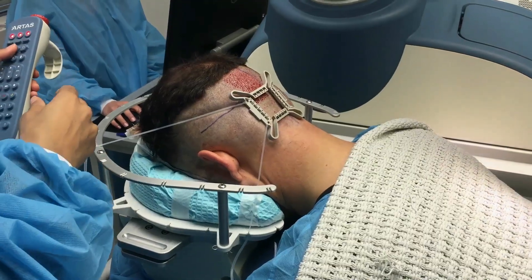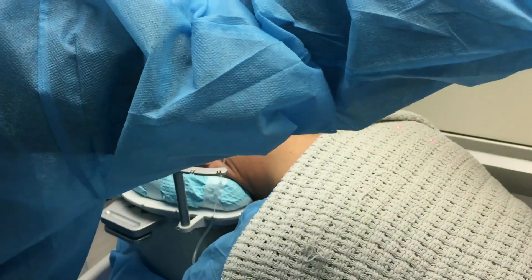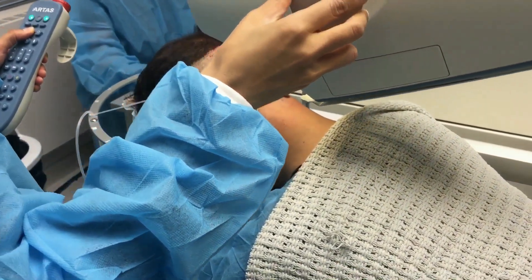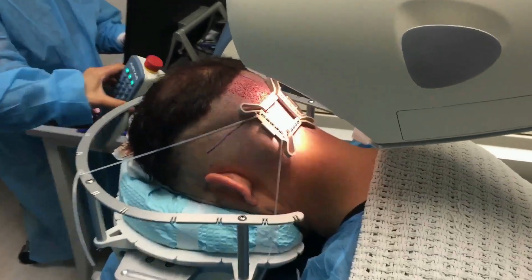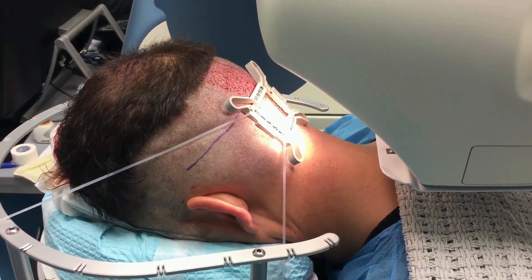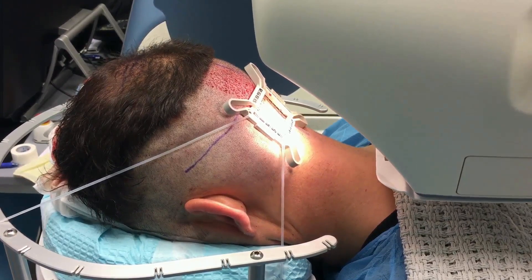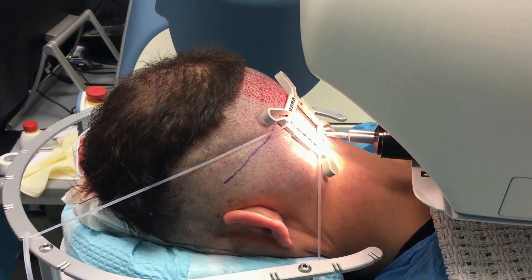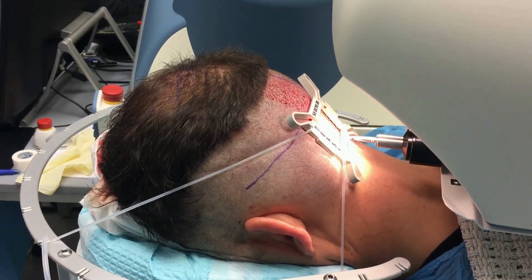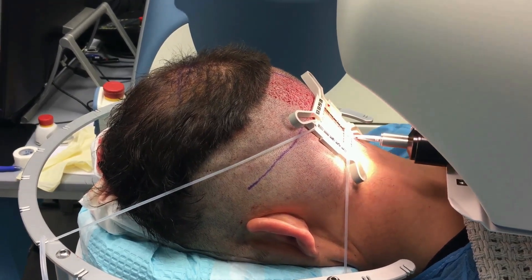The way we get the patient in position is we put a pillow on his chest to kind of flatten out his neck area. We tilt the headrest forward, and you can see by the wrinkles around his neck that his chin is tucked in all the way. This allows the robot to easily access the lower part of the back of the scalp. You don't want to go lower than this, or the scars will become visible.